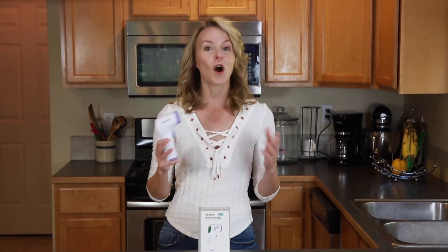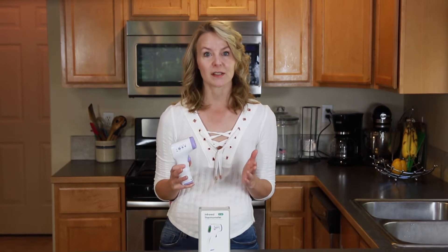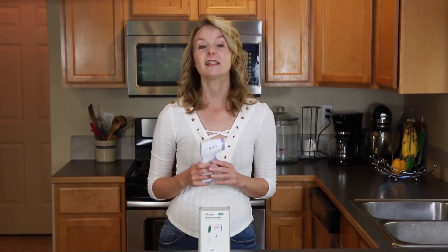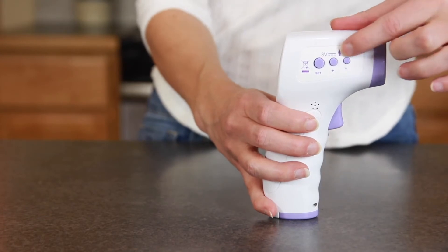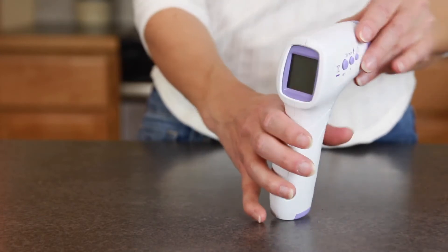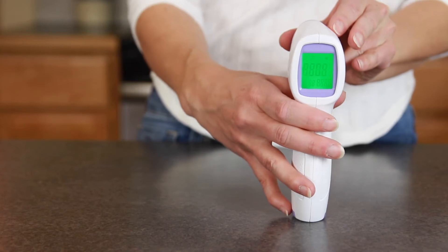With this thermometer, you can accurately test people who aren't showing any symptoms of illness. Because it's No Contact, it's much easier to use and keep clean than a mercury or even digital thermometer. It features a high-temperature alarm and an LED screen for easy reading.